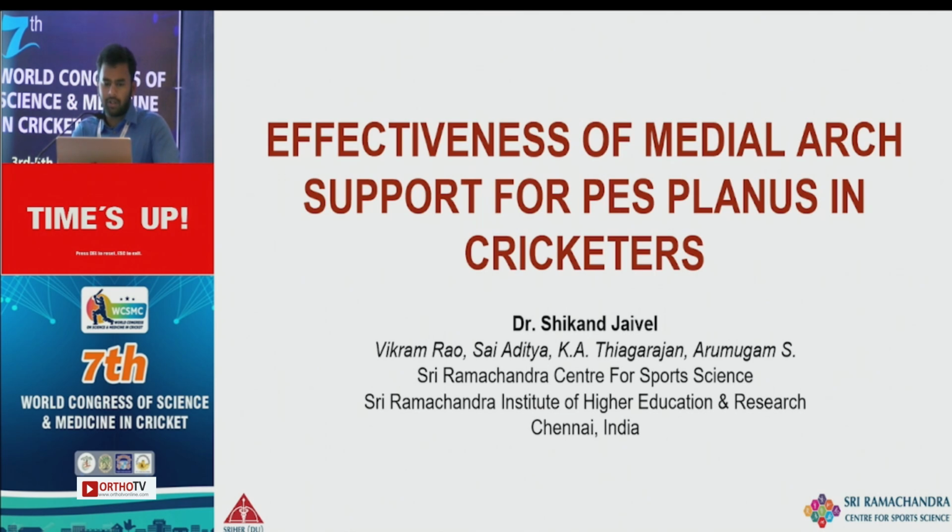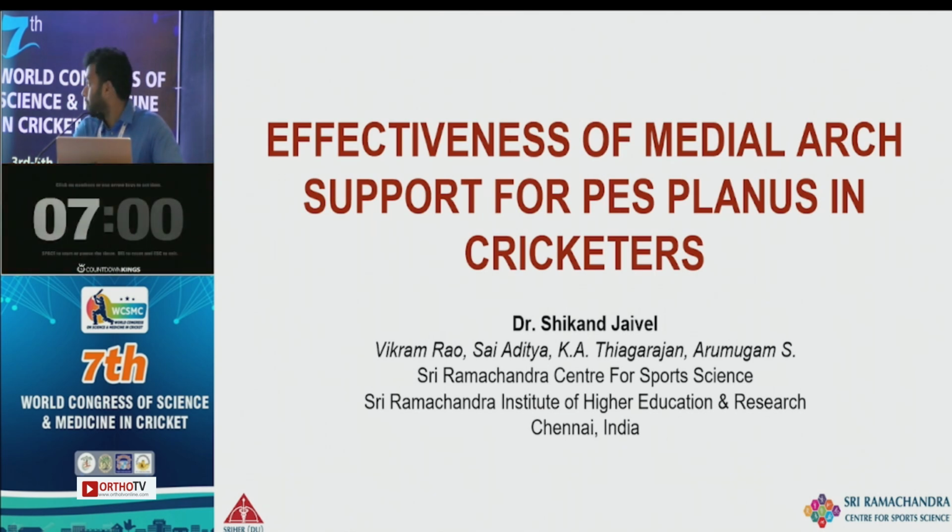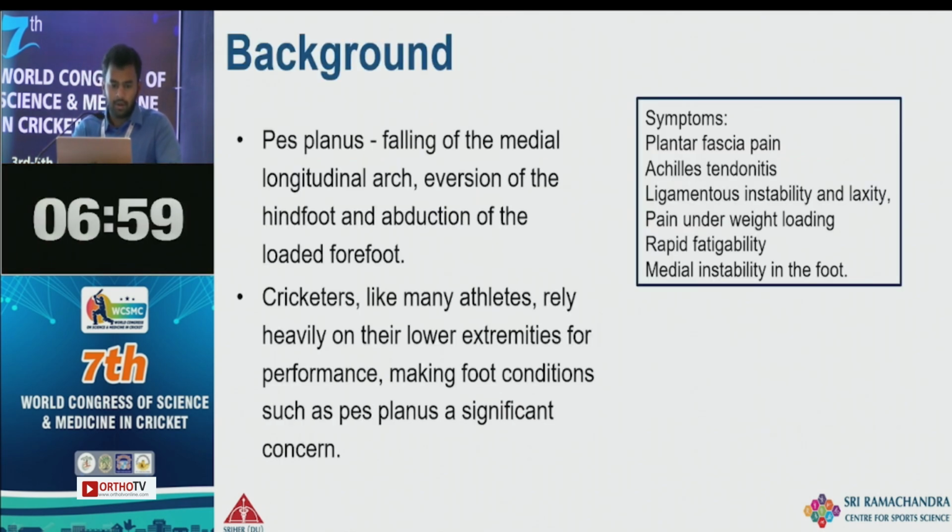I'll be presenting on the effectiveness of medial arch support for PES planus in cricketers. PES planus is falling of the medial longitudinal arch, eversion of the hind foot, and abduction of loaded forefoot. The symptoms of PES planus include plantar fascia pain, Achilles tendinitis, ligamentous instability, pain under weight bearing, and rapid fatigability. Cricketers, like many athletes, rely heavily on the lower extremities for performance, making foot conditions such as PES planus a significant concern.